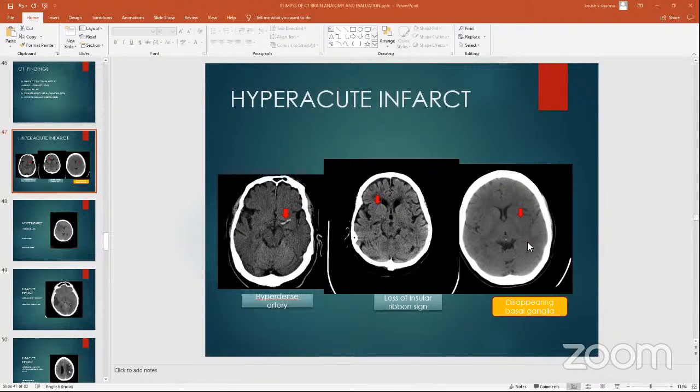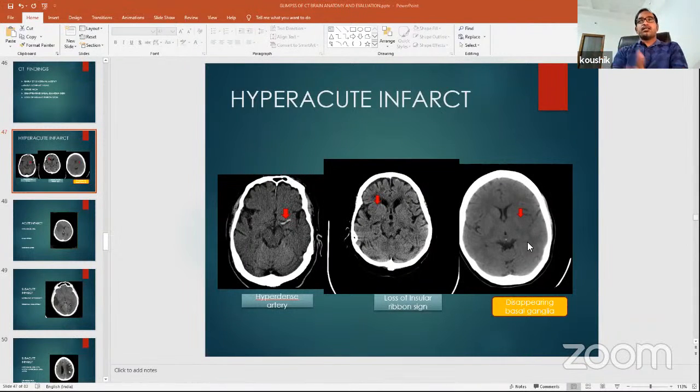Any role of normal CT or CECT for meningitis? In any case of meningitis, the first investigation of choice is contrast MRI. Second comes the contrast CT. In contrast CT, we can differentiate whether it is tuberculous or non-tuberculous meningitis.